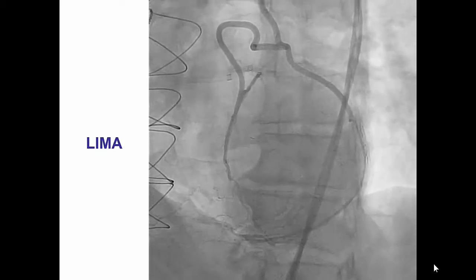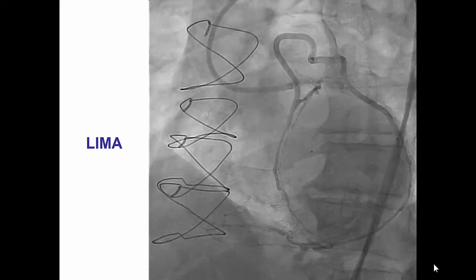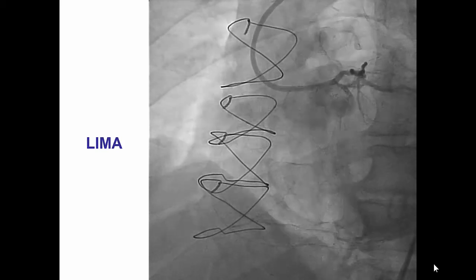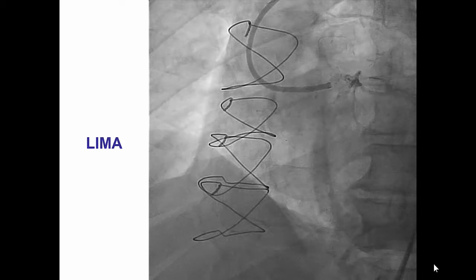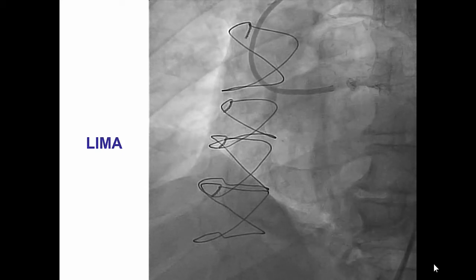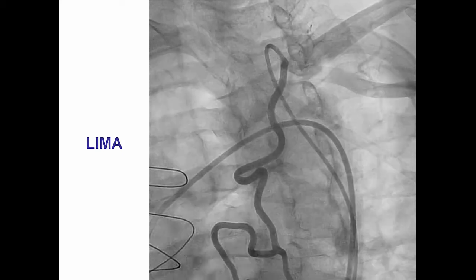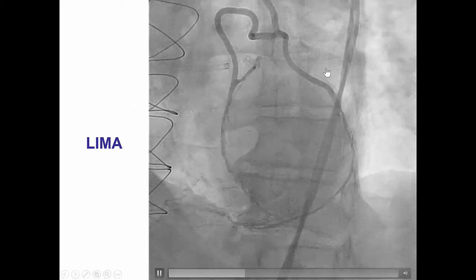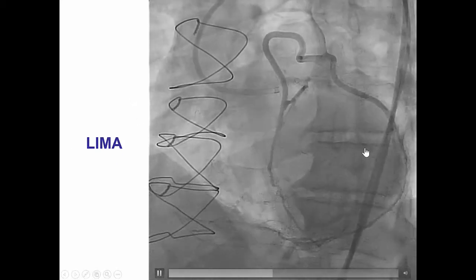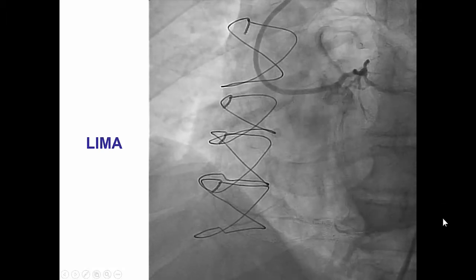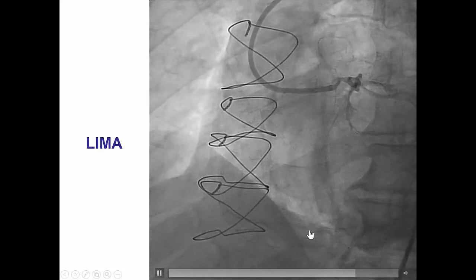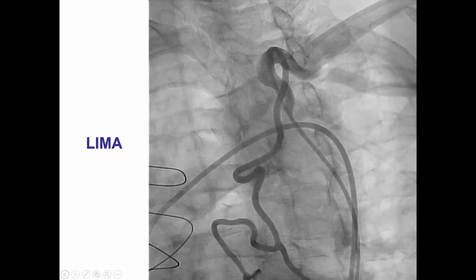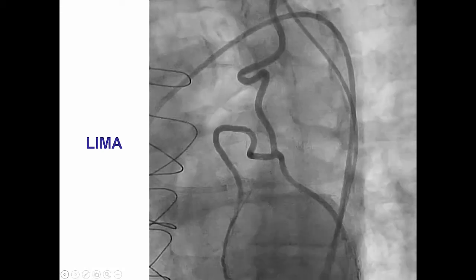Essentially all of the patient's heart was supplied from a LIMA bifurcating graft that had one branch going to the LAD and another branch supplying the obtuse marginal, which in turn, with a very large epicardial collateral, was supplying the distal right coronary artery.